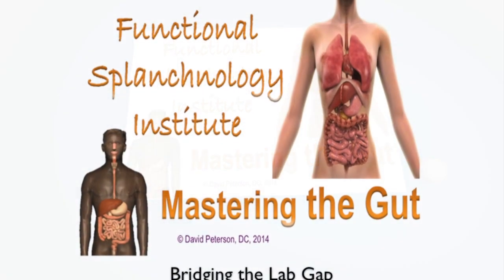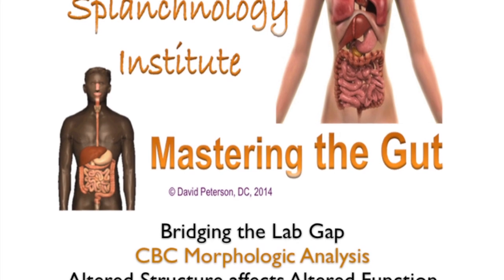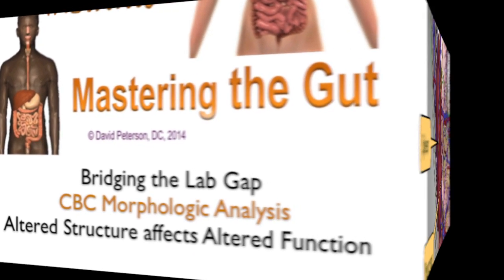Welcome to Mastering the Gut, Bridging the Lab Gap. Unit 1, Erythrocyte Morphologic Analysis.